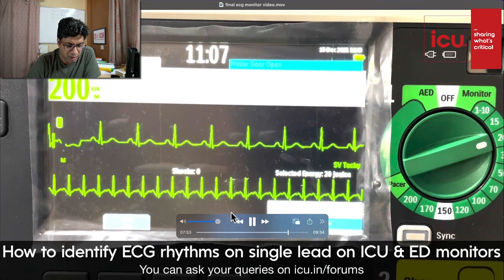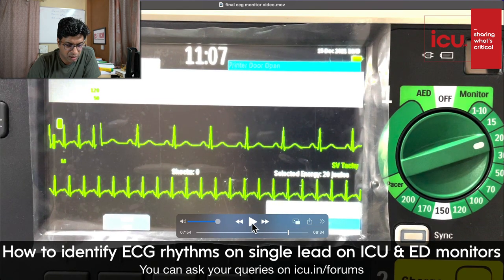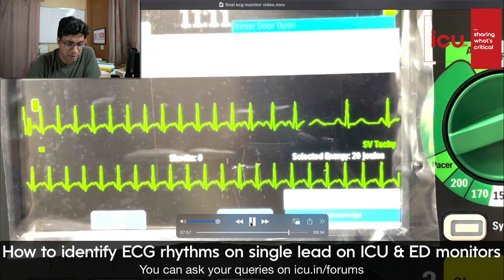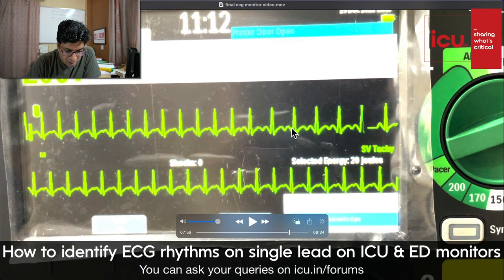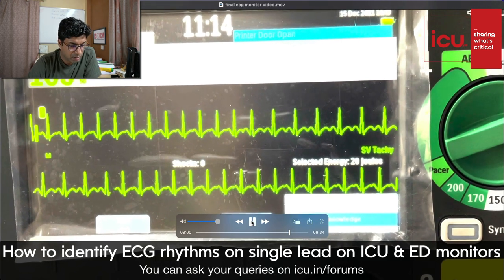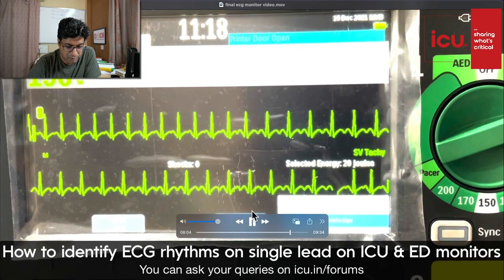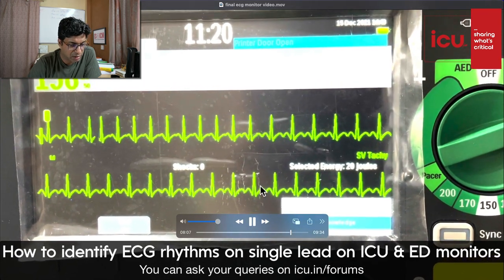So no P wave we can identify. It's a T wave, I think, usually. So this is SVT. Now the rate has slowed down, and here we can appreciate a P wave. I would say it's a P wave, so it is sinus tachycardia. But this was SVT. This could be sinus tachycardia.